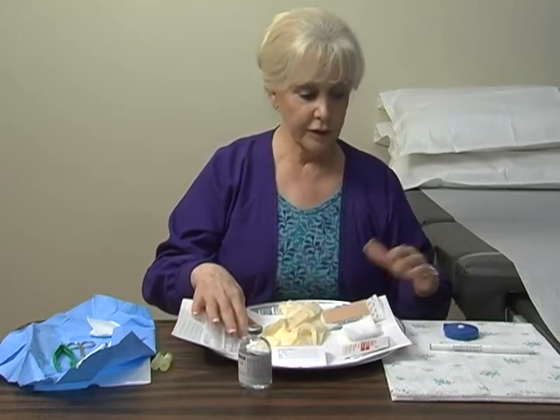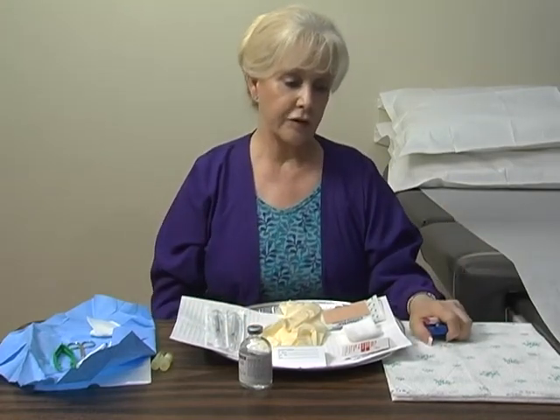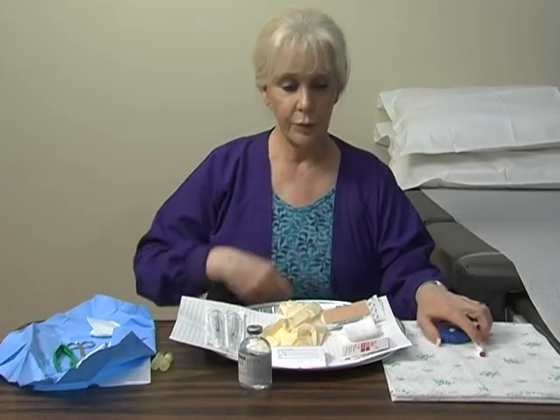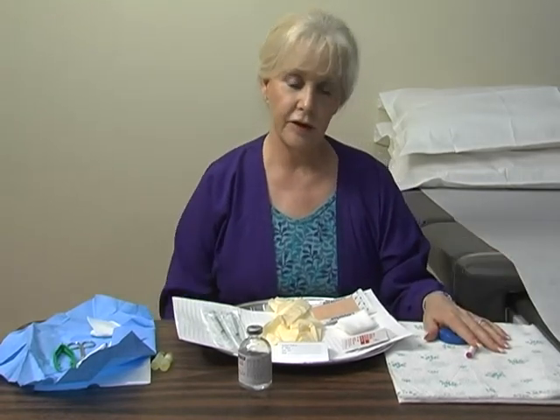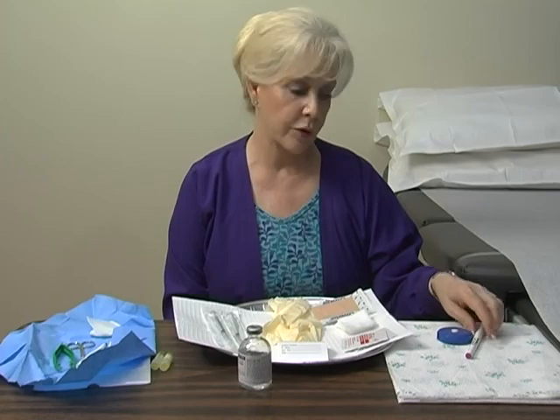Many patients — even if you are doing upper thighs — don't need to fully undress. Have them lower their pants and cover them with a drape, do the biopsy, and then they can pull their pants back up and lift the cuff of their pants. So having a drape just to cover them for privacy purposes is a good consideration.